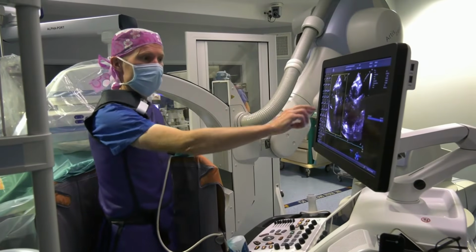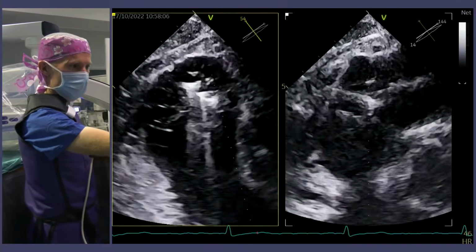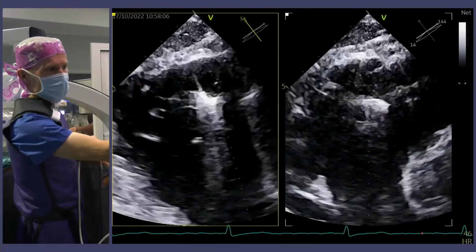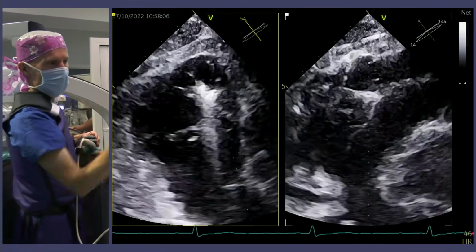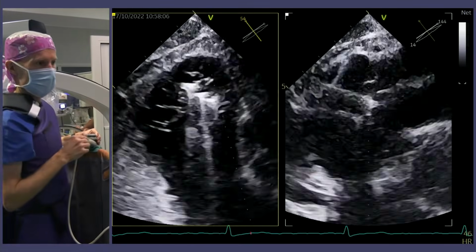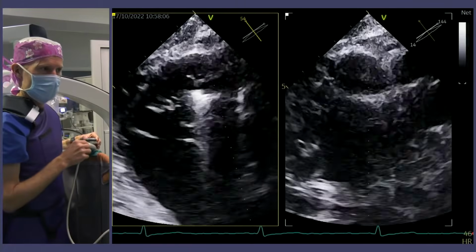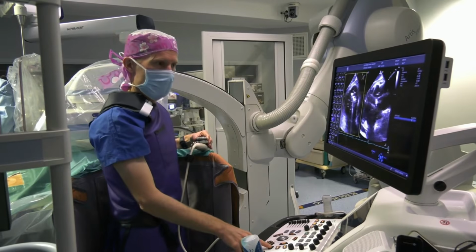So we add the clip that was positioned between the posterior and the septal leaflet. We use the transgastric view, and you see that we see quite nicely both leaflets coming close together, and it seems that the grasping was okay between the posterior and the septal leaflet. So we have one clip between the septal and the anterior leaflet, and the second clip between the posterior and the septal leaflet. And then we will assess the result using the color Doppler.